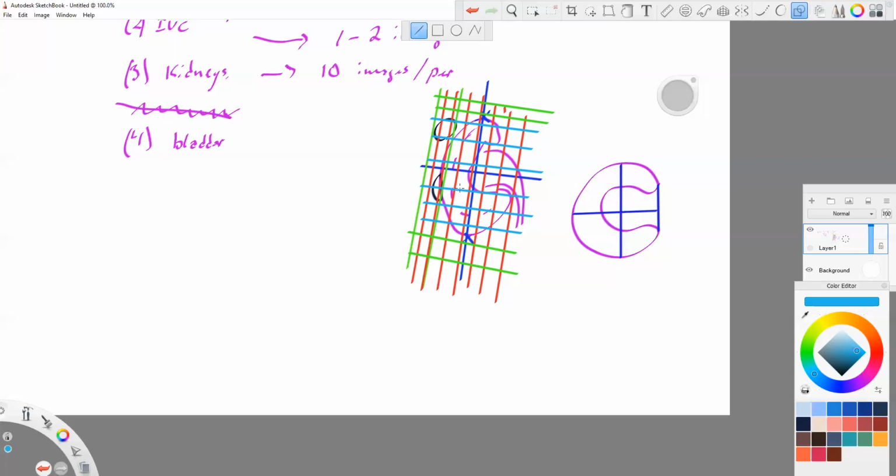But you could see, look at this grid pattern now. Have I missed anything? When we include the pale green, the light green here on the outside, actually I could have even thrown a couple of those out here as well. The light green being imaging I did without actually taking a picture. In other words, just scanning through.